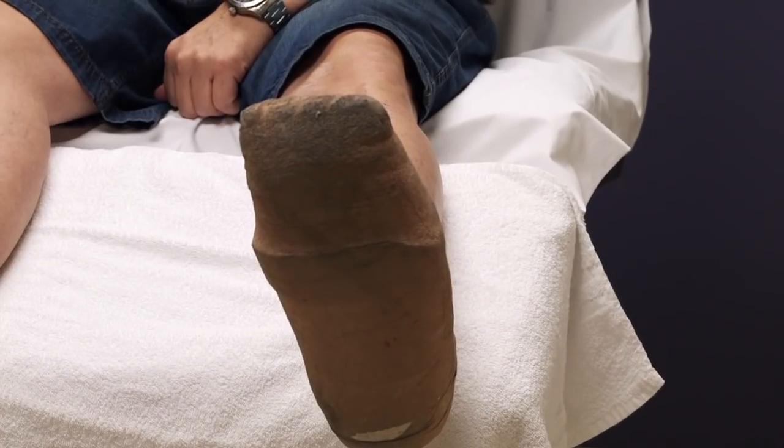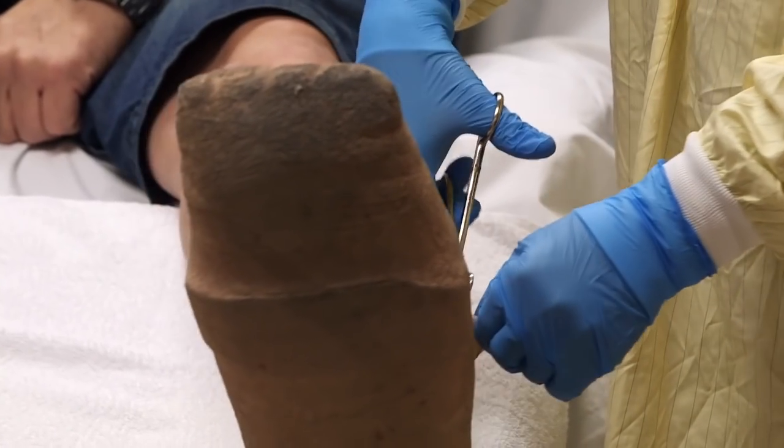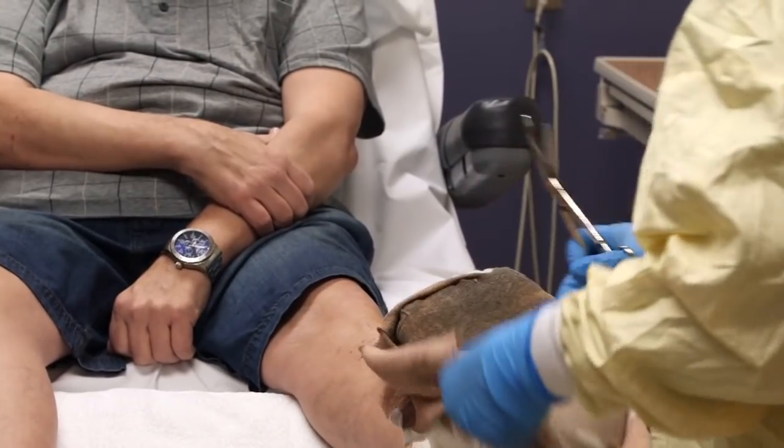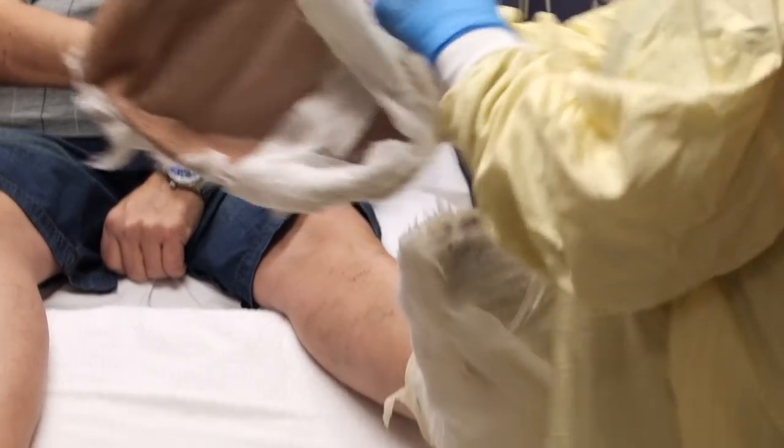When patients come to our clinic for the first time to be evaluated for a wound on their foot, we do a full evaluation of both the patient and the wound. We look at how well the patient's moving, where their wound is located, what caused the wound, but also the blood going into the leg — their arterial flow.